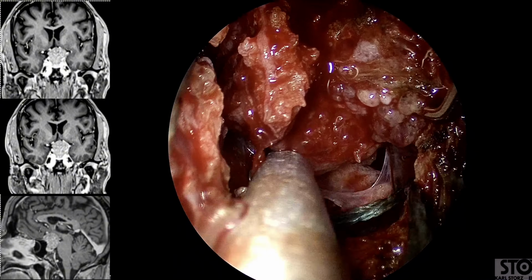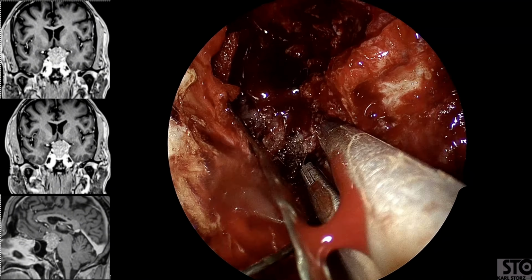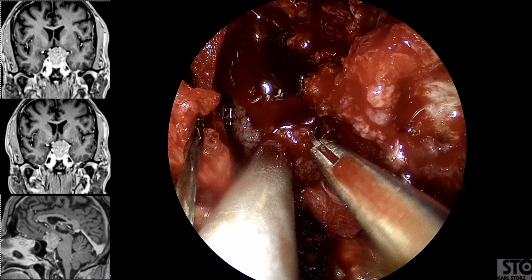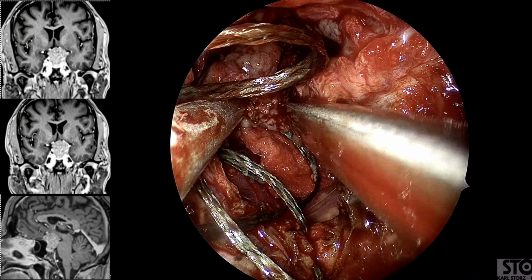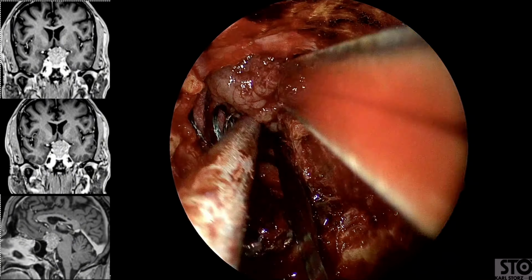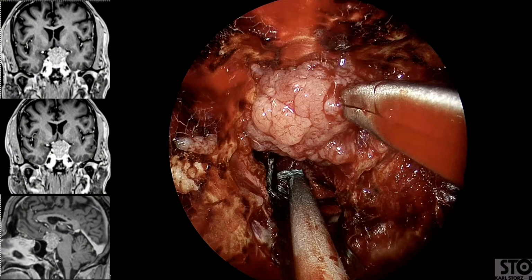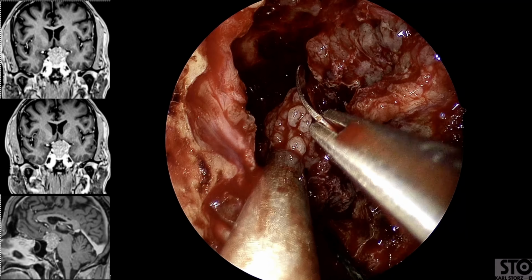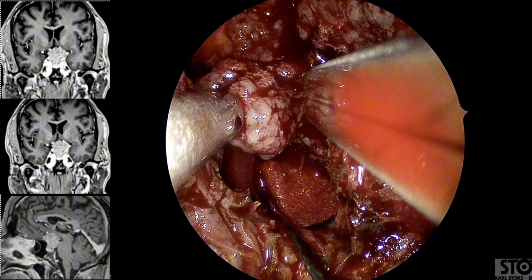The tumor is adherent to the left internal carotid artery, so a thin margin is intentionally left to avoid injury to critical branches and perforators. We proceed with sharp dissection to remove the central tumor bulk, particularly in the portion compressing the midline and right side. Gentle traction with cottonoids is used to protect perforators, including the superior hypophyseal arteries and perforators from the basilar artery. We control suction and continue dissection of the tumor's posterior capsule. With controlled suction and continued dissection, the tumor posterior to the internal carotid artery is mobilized, rotated, and finally removed.